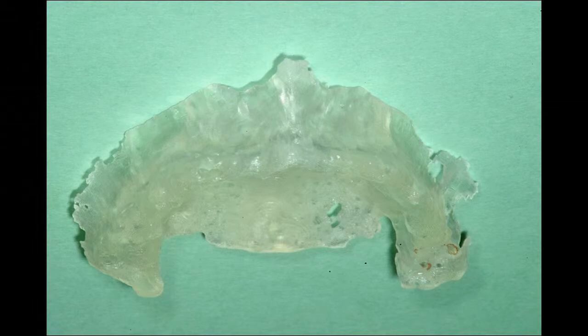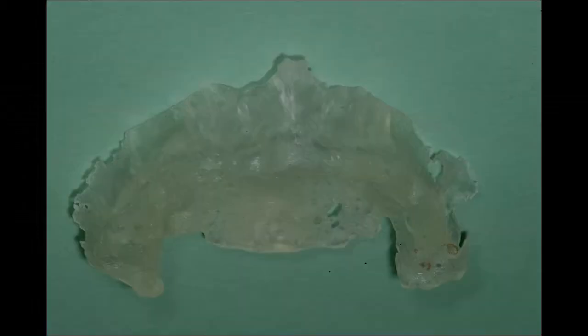None of this is being done in the mouth. I'm just going to snap this into here, snap that into there, and then make sure I have enough room here. Put my locator housing on here, flow some acrylic there, and just seat the bar in there and let it set up. And so that's what you see here. There's a quick set acrylic, housings inside of there. There's our solder joint. There's the original bar back here.